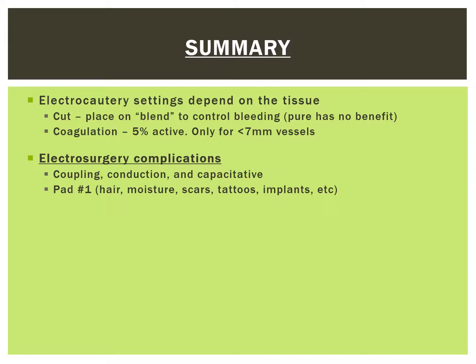Always be aware of the complications of electrosurgery, including coupling, conduction, and capacitive complications. Always check the padding. This is the number one source of complications, and look out for any hair, moisture, scars, tattoos, and implants.